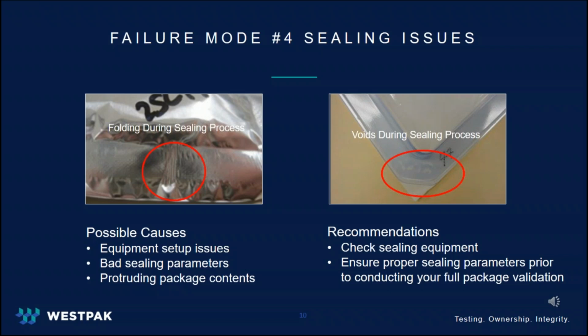After you have sealed your pouches, you should conduct a visual inspection of the seal prior to testing to identify this issue. The picture of the tray on the right shows a sealing issue that was most likely caused by improper sealing parameters, such as a sealing temperature that is too low or a sealing duration that was too short. This may have been caused also by imperfections or obstructions located in the sealing surface. To prevent this issue, you can inspect the seal area prior to conducting your sealing. Also, conduct a pre-validation of your sealing parameters prior to conducting a full validation of your package systems.